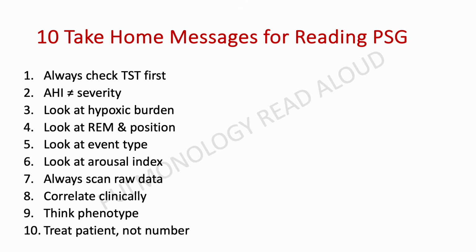So with that, 10 take-home messages for reading a PSG: always check TST first, not correlating AHI and severity, looking at the hypoxic burden, the various phenotypes, looking at arousal indices, looking at the raw data yourself, correlating clinically, thinking the phenotype, and treating the patient as a whole.